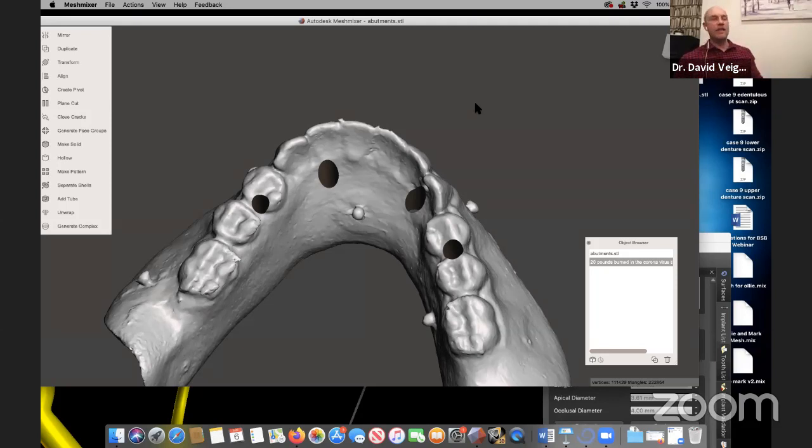And why I do it this way is, the traditional way of doing it is you set up denture teeth and you try the denture teeth in. But what I found is that my patients then say, well, you tried something in that looked like denture teeth, but then you gave me something else in my final restoration that doesn't actually look like denture teeth, unless you're converting it into an actual hybrid prosthesis. And I don't do a lot of hybrid prostheses anymore. I tend to do composite wraps on metal, or like a BDT type bridge with thimbles and individual crowns on it, something like that. I don't tend to do bars with acrylic wrap on them anymore.